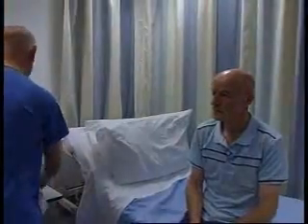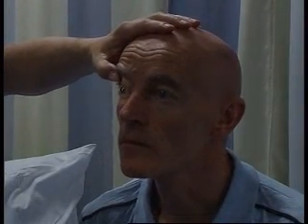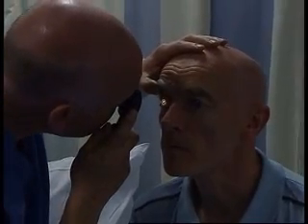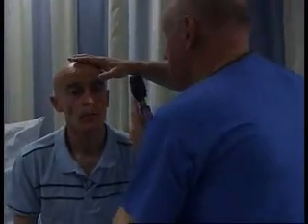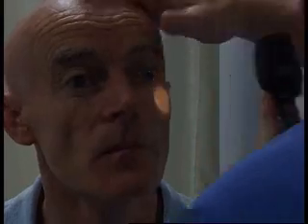The next part of the examination is the optic fundi, and for this we need to dim the lights as much as possible. We use an ophthalmoscope, and when neurologists use an ophthalmoscope, it's not quite the same role as ophthalmologists. We want to look at the optic fundi to make sure, principally, that there's no papilledema or optic atrophy. I'm going to ask you to look straight ahead, Hugh. I'm just going to steady your eye and move this light into your eye. And now I'm going to use the other side — I'm using my left eye for his left.